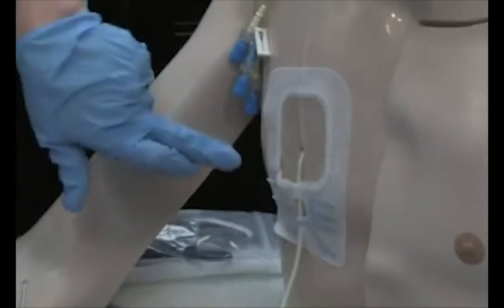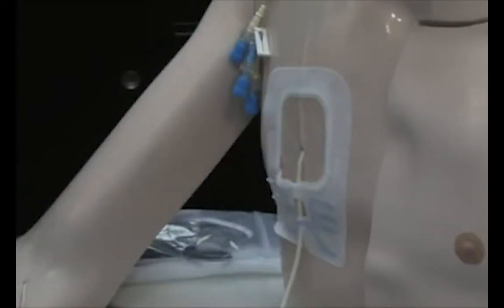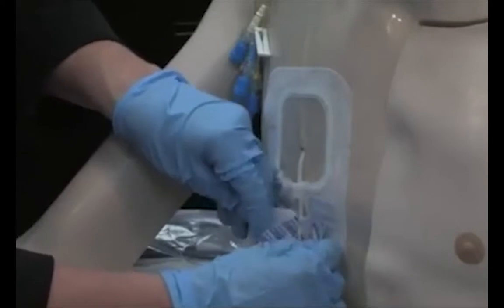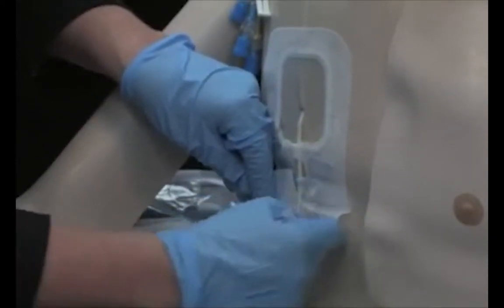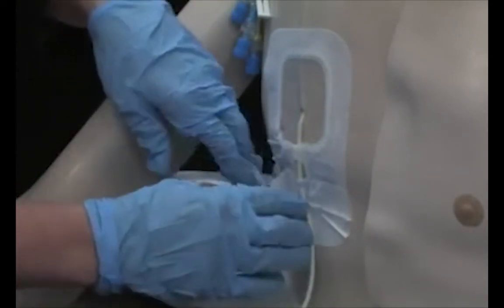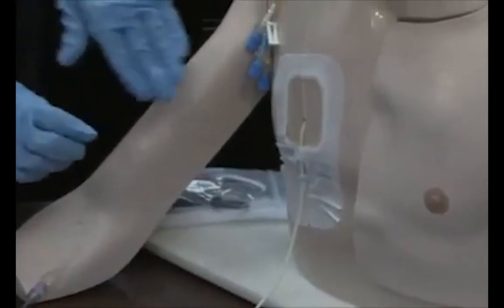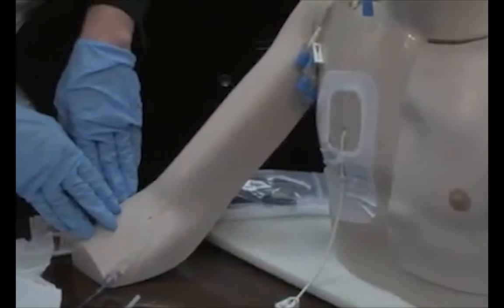I would, of course, consider putting it at a different angle and not going over this area right here, just for the comfort of the patient. Then this piece is put on like this. Now, of course, with putting this on, my gloves are no longer sterile. They're just clean. And that's how you put on the Sorbaview. And the same technique is used on a PICC line.